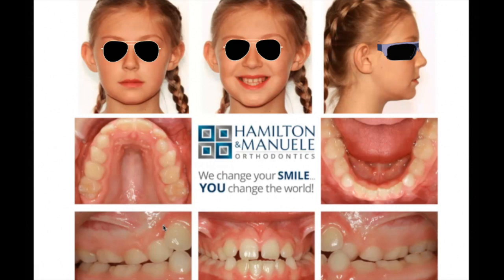All right, we're going to expand. We can design the expander. What kind of expander do you want to use? What's that? Bonded RPE? What teeth are you going to cover? All right, you could do all the way 6s to Cs. That would give you even more anchorage on the Cs there. Or you could do 6s to Ds, usually pretty sufficient in a patient this age.